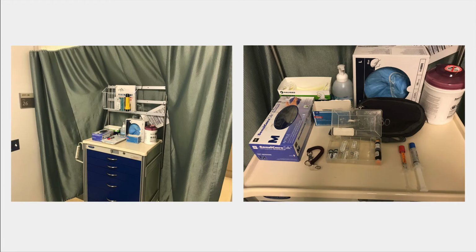So now you've got the room set up, you've got the patient in place. As you turn to the right, assuming that the table's on the left-hand side of the bed, you'll draw the curtain over the epidural cart here. And this is to emphasize what this is supposed to look like to give patient privacy during the procedure itself.